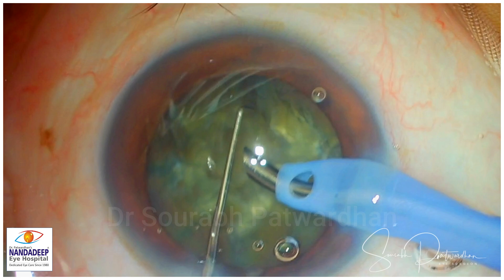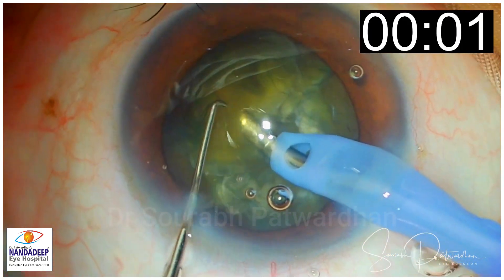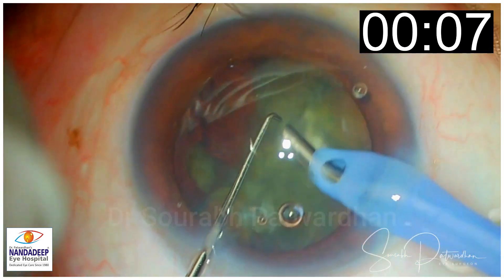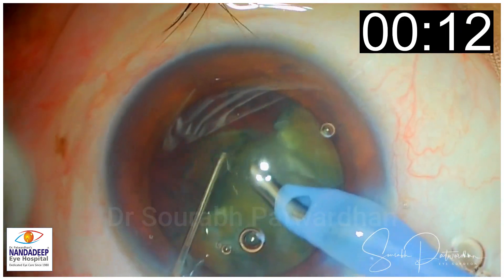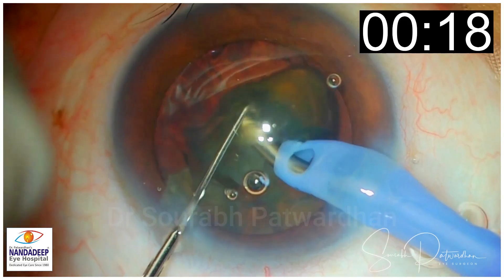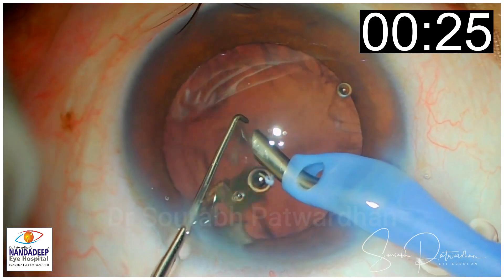So this was the video. I am just replaying the video of the surgery — just watch again carefully how the quadrant removal takes place. It's very efficient, very quick. And then I will analyze each and every step and share what were the reasons for quick quadrant removal without causing any risk of complication.